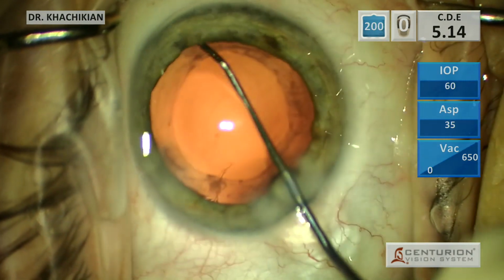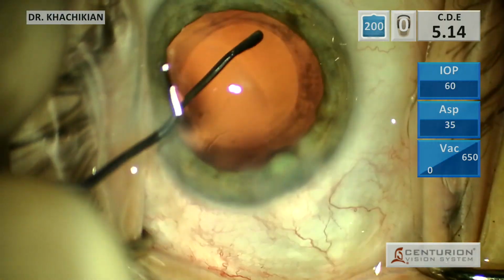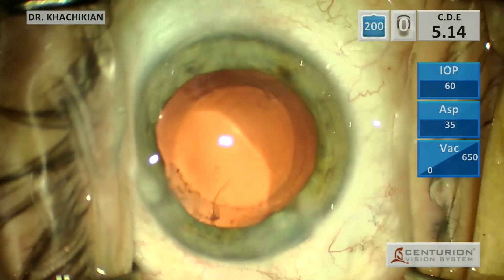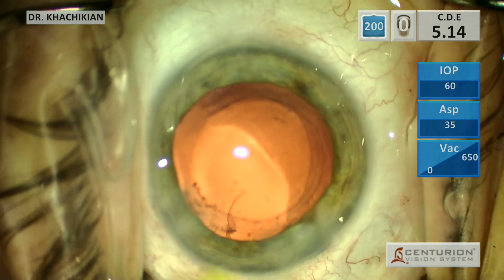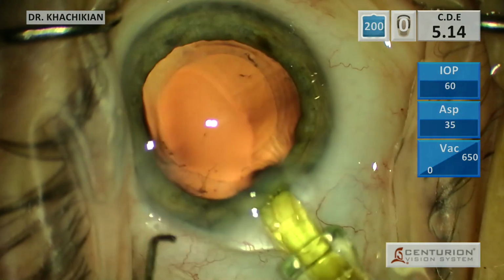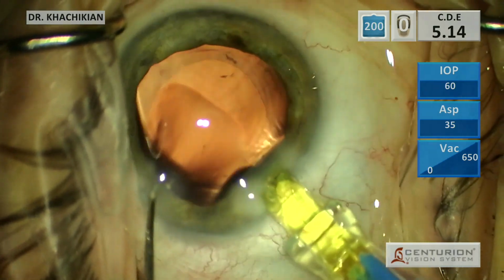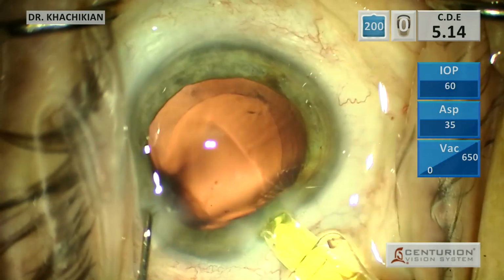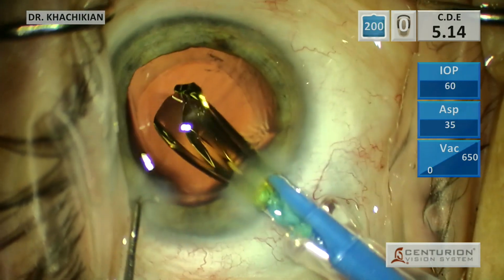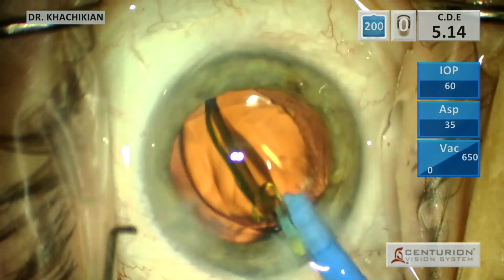But it's key to notice that as I was pulling on that cortex, even though it looked like just a little bit of cortex remaining and just a few strands, those posterior zonules were so weak, it was pulling the entire bag. If you're too aggressive, you're going to dislocate all of those zonules on the temporal half there, and you'll probably still be able to put in just a standard capsular tension ring, but if you do too much, you may wind up putting in a capsular tension segment and having to anchor that to the scleral wall. You want to avoid that if you can.